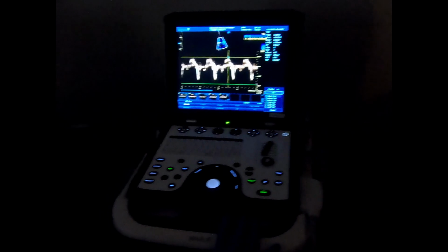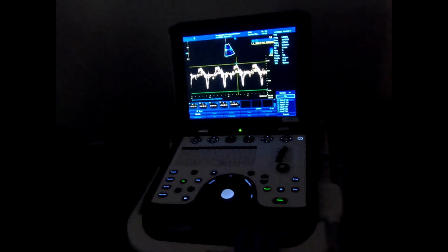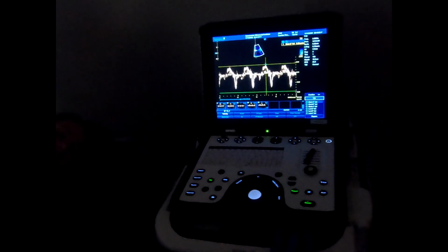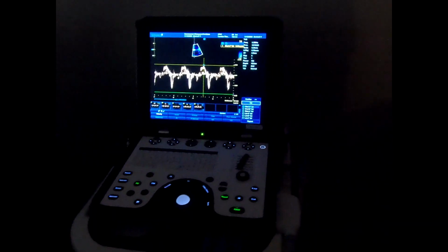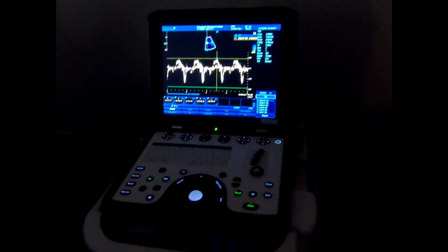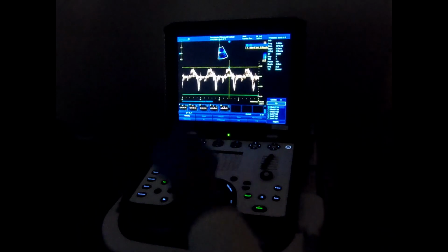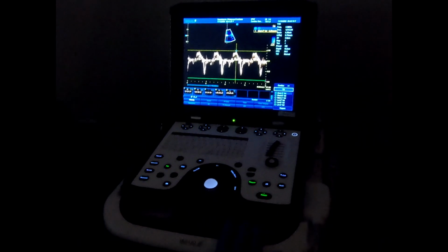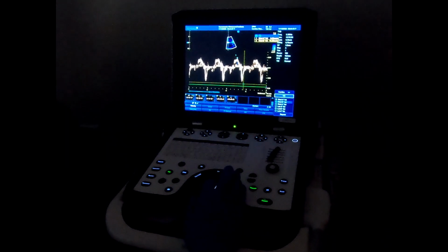What's the normal velocity for S? Normal is 0.6 to 1.3? It's supposed to be less than 10 for medial. For medial, 7 to 8, I told you, yes? So anything more than 8. So it's 9.29. Good job. Good systolic function, okay?